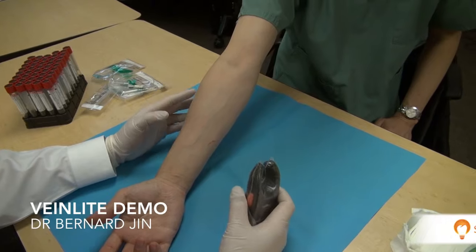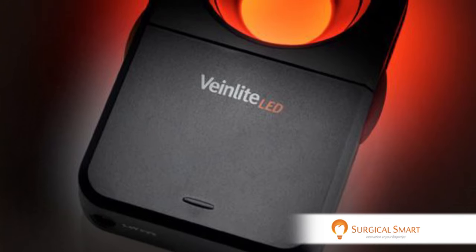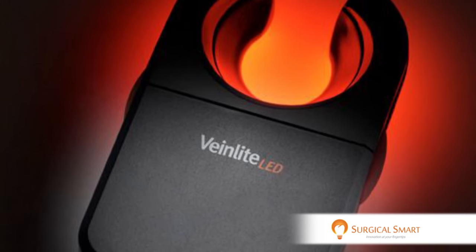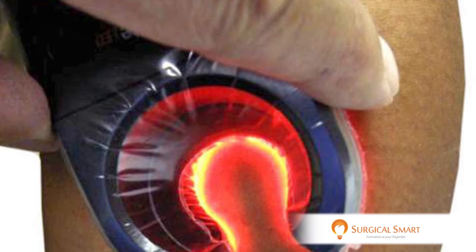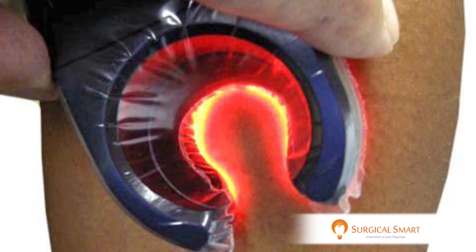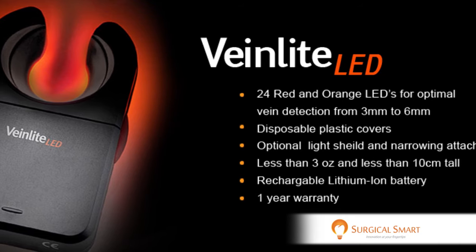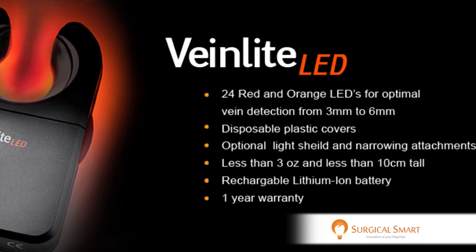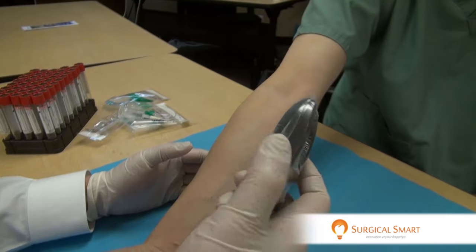Hi everybody, this is Dr. Jin here and I just wanted to share with you this amazing tool called the Veinlite. Most of you who have taken our PRF course will realize that one of the most challenging things to do is to actually perform proper venipuncture — in other words, actually getting the blood. Unless you're doing venipuncture on a regular basis, performing the blood draw can actually be quite challenging. This tool, the Veinlite, allows you to visualize and localize the vein so that you can perform a better job at venipuncture.